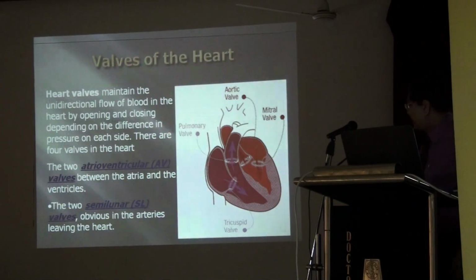In earlier days, to get, for example, the pulmonary valve and its pressure gradient, we used to do an invasive procedure under the different right heart studies, and the Swan-Ganz catheter was put inside the heart to know the various pressure gradients. But now it is a non-invasive method for getting the gradient very immediately.